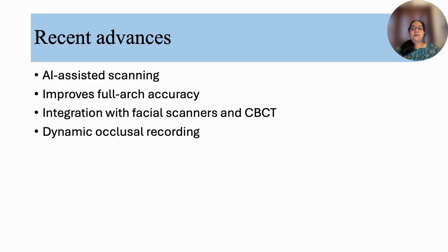Recent developments are mainly focused on improving accuracy and digital integration: AI assisted scanning, better full arch accuracy, integration of facial scanners along with CBCT, and dynamic occlusal recording with the help of jaw tracking devices. These are all going to be the future of prosthodontics.